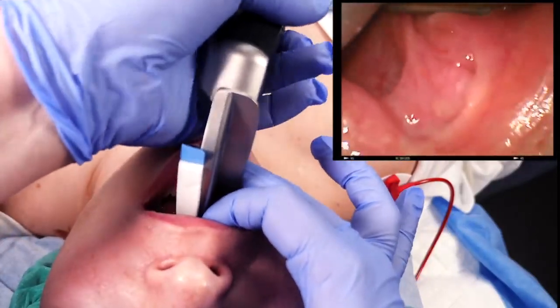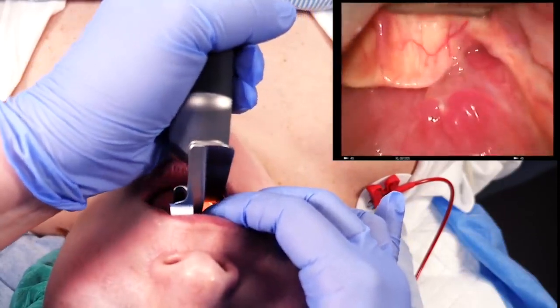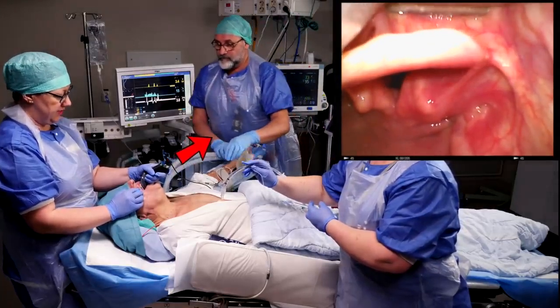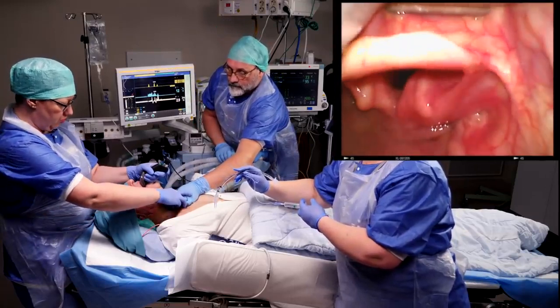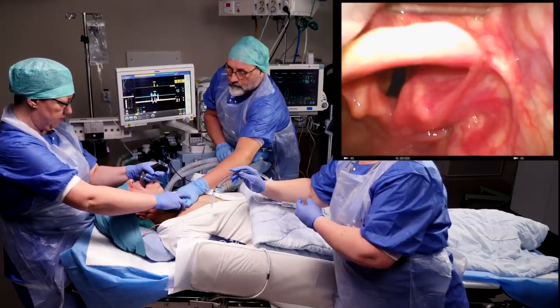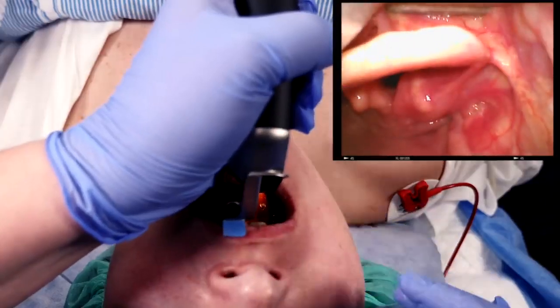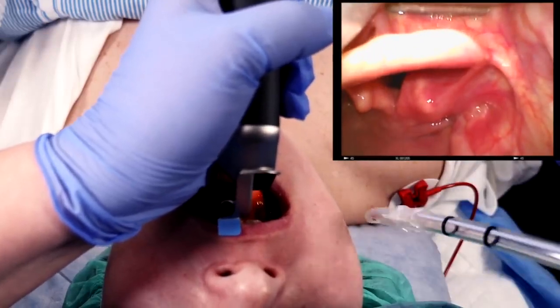Advance the blade until you see the epiglottis and place the tip in the vallecula, the recess at the base of the tongue. At this point, you can start to apply some force in the direction of the laryngoscope shaft. Sometimes a light external force on the larynx can make the vocal cords spring into view. Ask for your assistant's hand and move it to apply backwards, upwards, rightward pressure, or burp for short. Make sure you don't pinch the lips and do not exert any pressure on the front incisors.